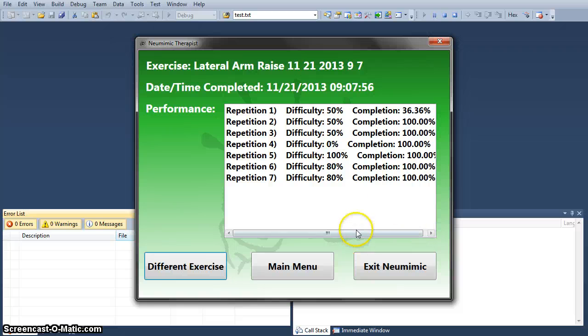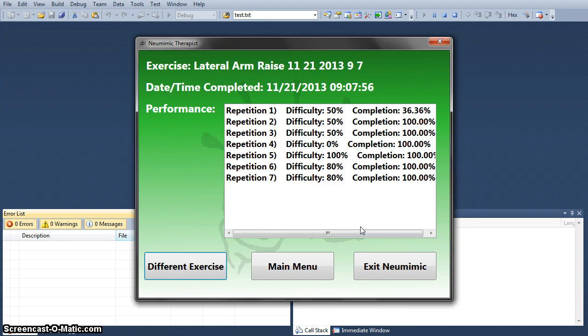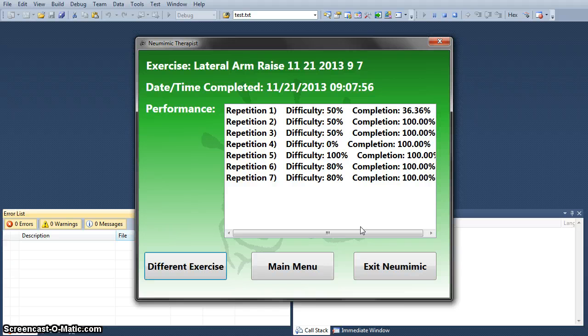All right. This is a record of what I actually did at what difficulty, what percentage complete. What this will allow the doctor to do is see how his or her patients are doing and track progress.